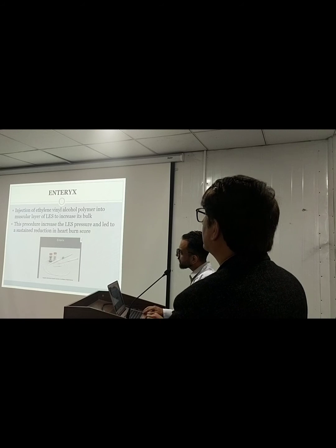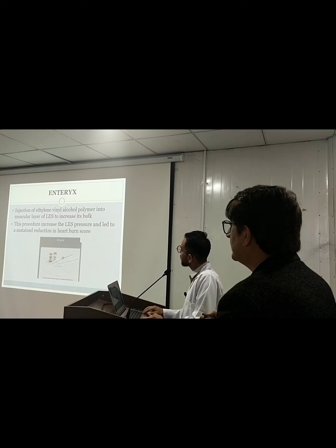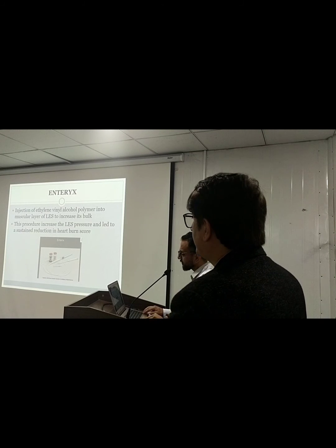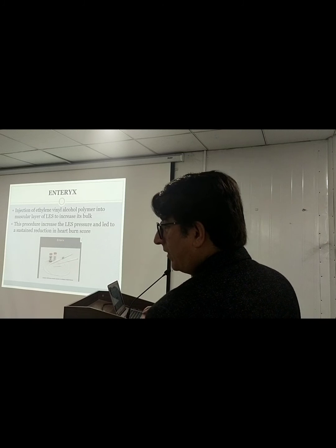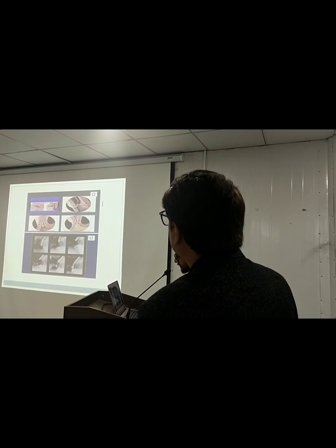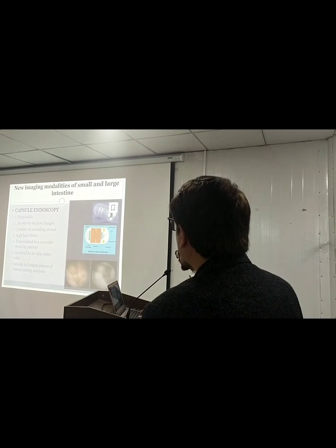Enteryx is basically the injection of ethylene vinyl alcohol polymer into the muscular layer of the LES to increase its bulk. All these techniques are basically for therapeutic purposes. The procedure increases the LES pressure and leads to a sustained reduction in heartburn score. So this is also more advanced than the Stretta technique. These are pictures we have only seen in pictures.